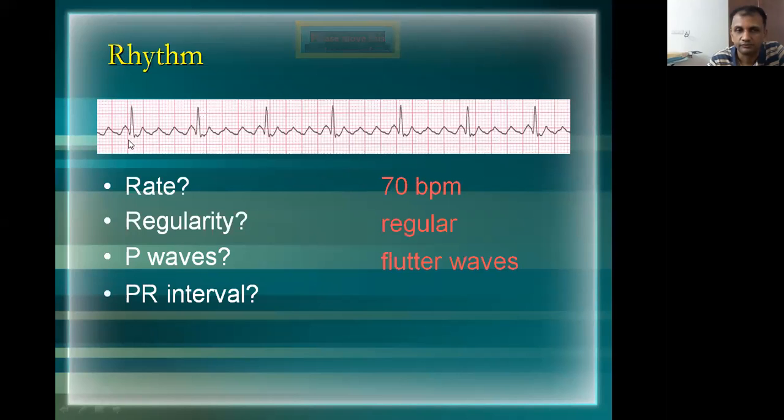Yeah, this is a flutter wave, more like a pointed one.